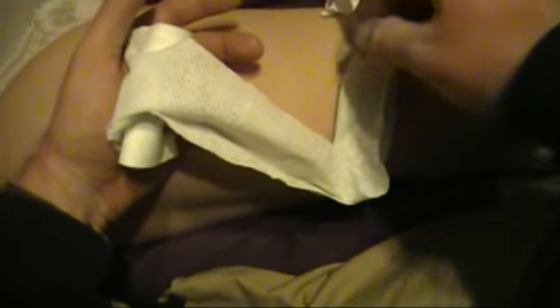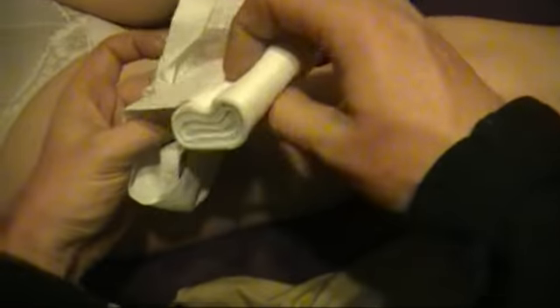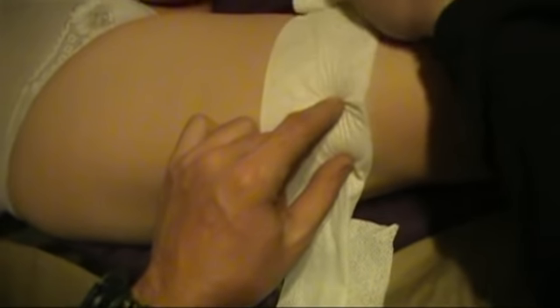Now, that's the problem with the powdery stuff: if you have a small hole, you're not going to be able to really get into there. And yes, a bullet wound could cause that sort of problem, where you have a small little hole but a lot of bleeding coming out because it tagged something internally. But with this stuff, like I said, you pack it in. Even though it is rolled, it is not to be wrapped around the wound. It is to be stuffed in the wound.